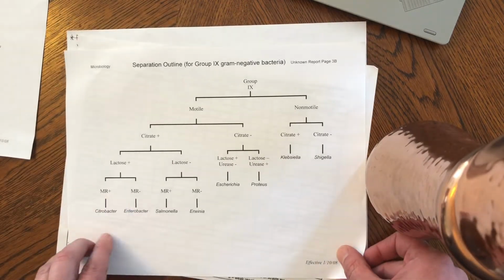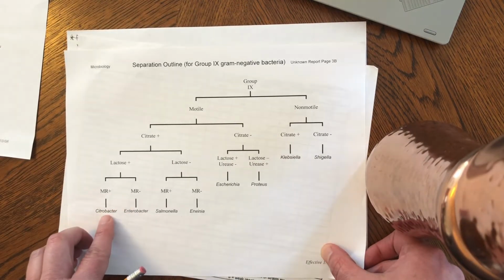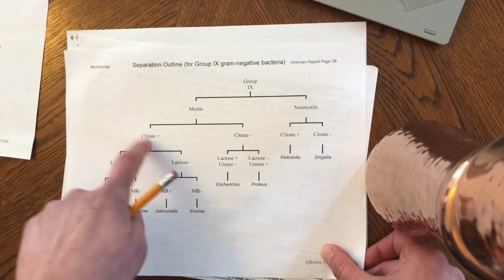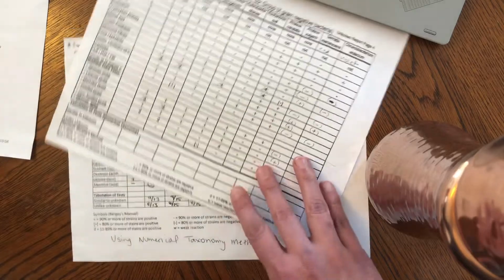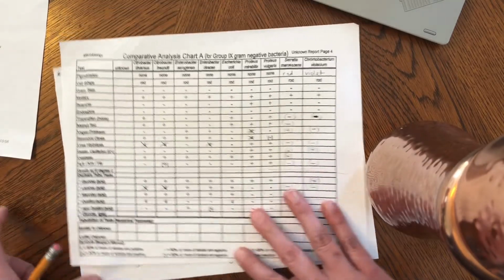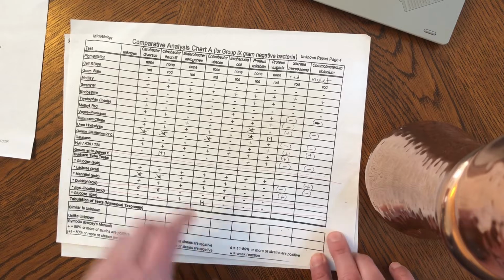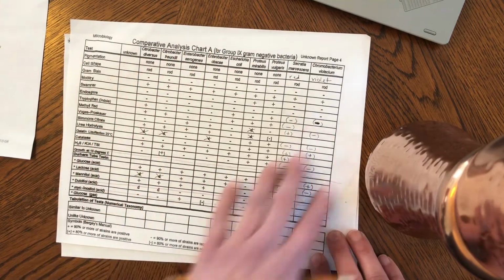So if we're working backwards here, again, you may end up, it's Citrobacter here, but you may not actually have Citrobacter. This is only giving you 1, 2, 3, 4 test results. This is giving you all of the test results. And I think there's 15 or 16, actually maybe 17 here. So you need to finish, I have finished this out for you.